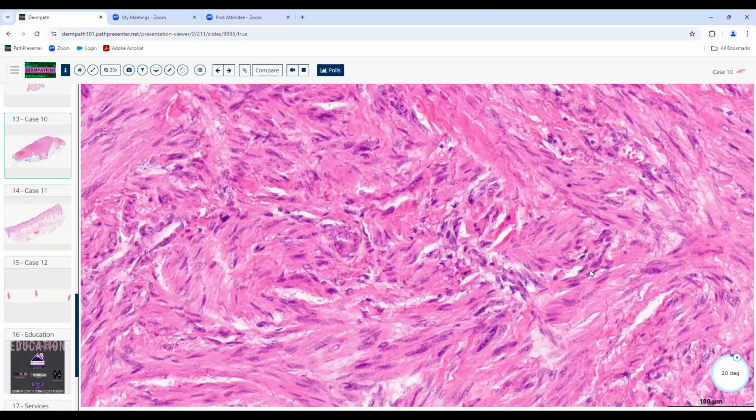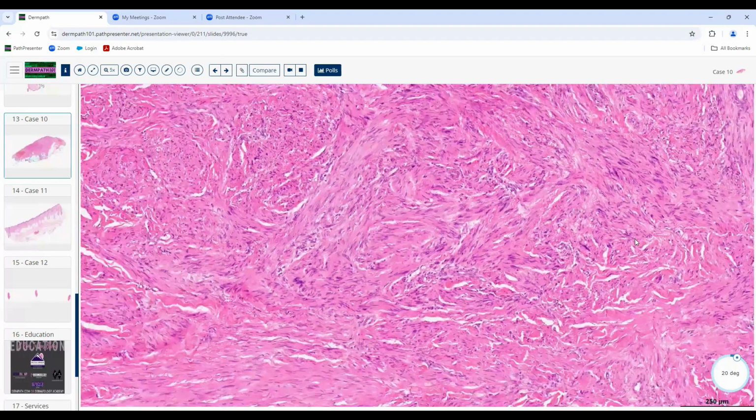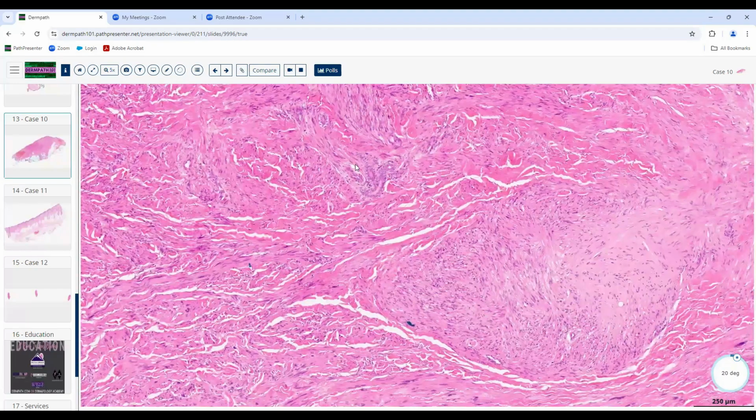If you look at the way the soft tissue pathologists grade these things, they call them leiomyomas, atypical leiomyomas, and then leiomyosarcoma. This one we called a leiomyosarcoma because it was large, it was asymmetrical, it was deep, and it had a lot of mitotic figures and other features.